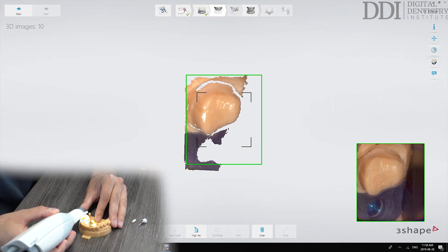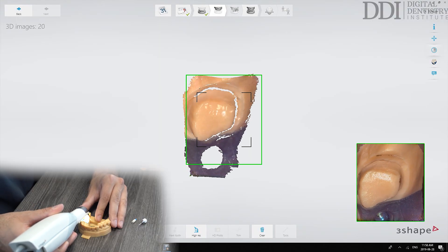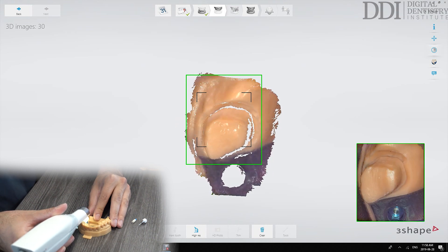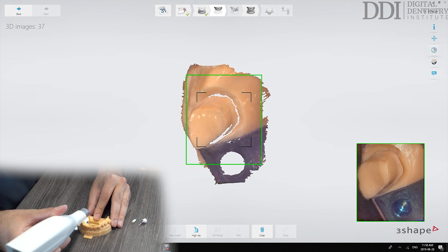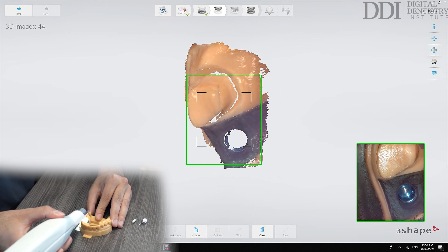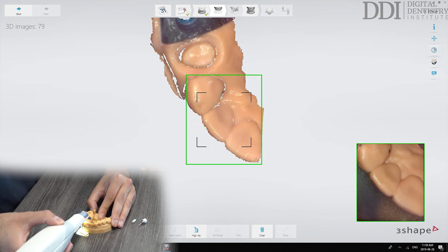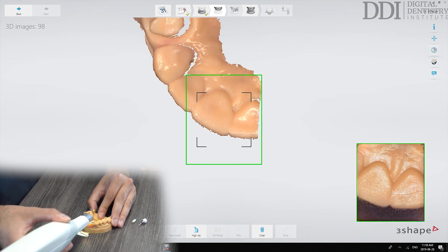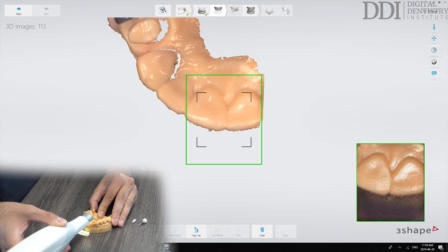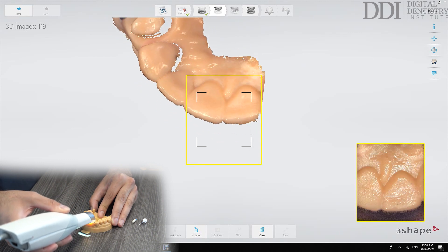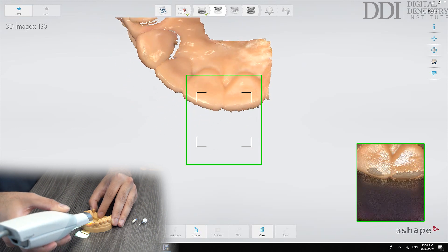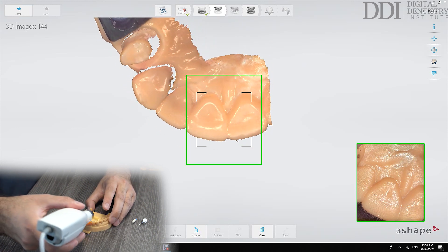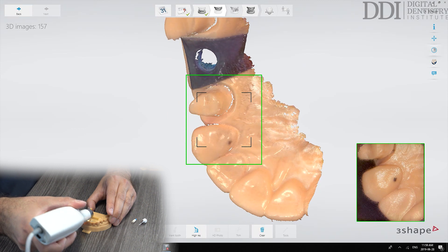So again we follow the same protocol where we're capturing the occlusal surfaces. We're paying a lot more attention at this stage to make sure we capture all the margins on those crowns. When we get to the anterior region it makes it easier to capture everything if we start tilting the scanner tip in this rainbow motion before moving down to the palatal aspect capturing the palatal surfaces.